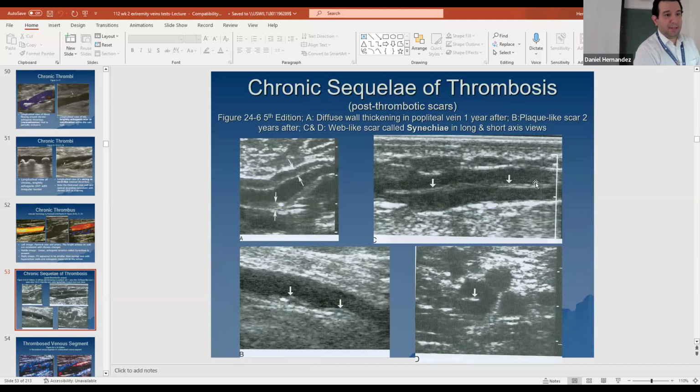So I've seen them right down the middle. It looks like what is right down the middle of your vessel here, adhered to the walls. You can see a little echogenic part over here. Transverse, you could see that scarring coming across the vessel. So it almost looks like a dissection. If this was an artery, I would say, hey, that's a dissection, but we know that this is a vein, that represents that linear scar. So this is what it looks like here in transverse. We see it affixed to the wall here, extending across. If you imagine, it's this thin, flat thing going across, and we're slicing it this way, and we can see it coming through the middle of that vessel.